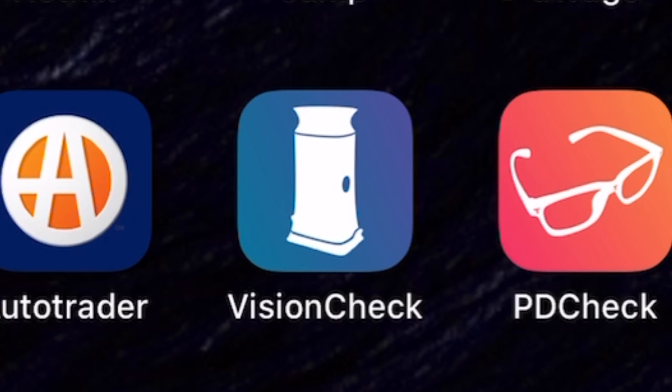The first thing to know is you have to download the Vision Check app from the App Store. Once you download that, you're going to create an account, and in your particular kit there will be a little QR code or authorization code.